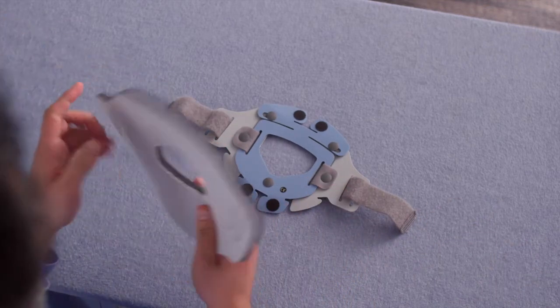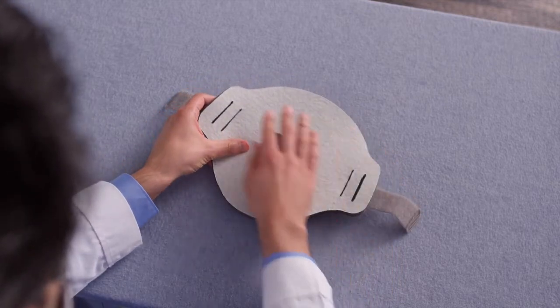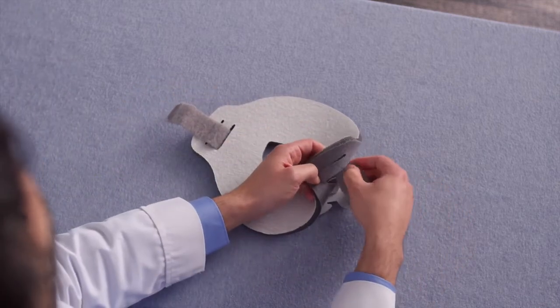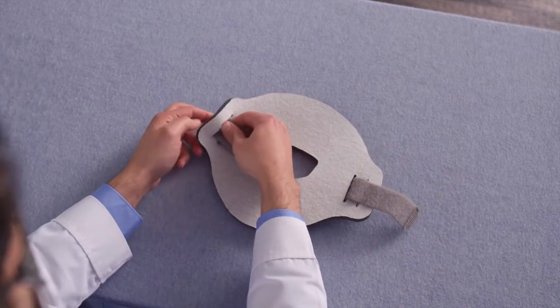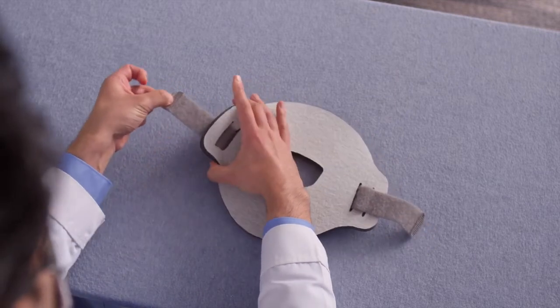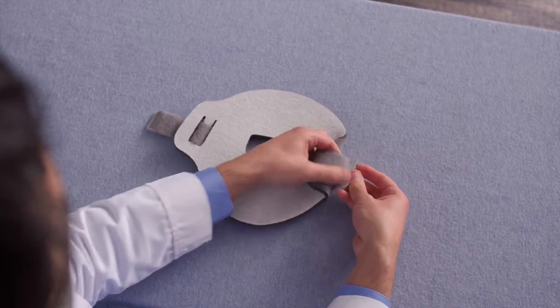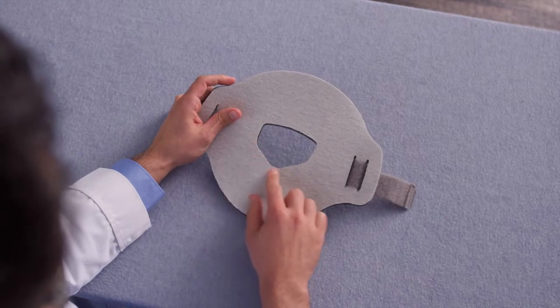To replace the pad, start by threading the strap through the inner slot on both sides of the pad, and then center the pad on the posterior plate. Take the straps and thread them back through the outer slots on the pad and the outer slot on the posterior plate, and pull them through. Use the window as a guide for centering the pad.